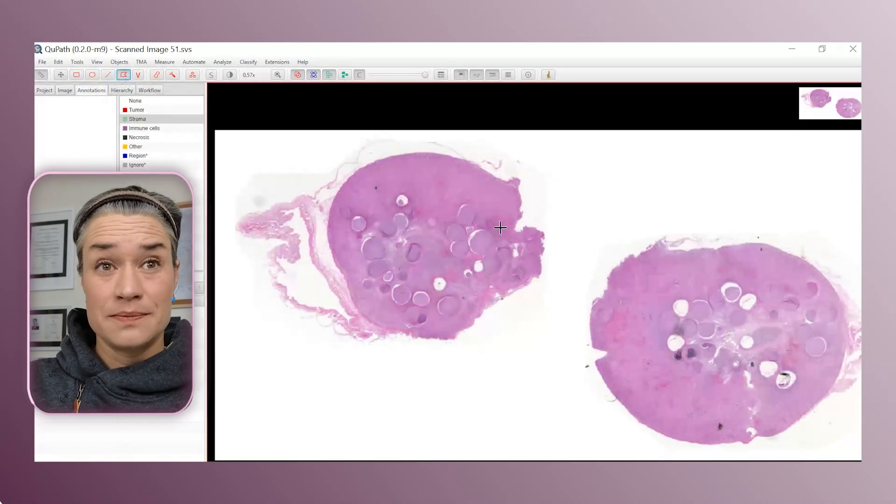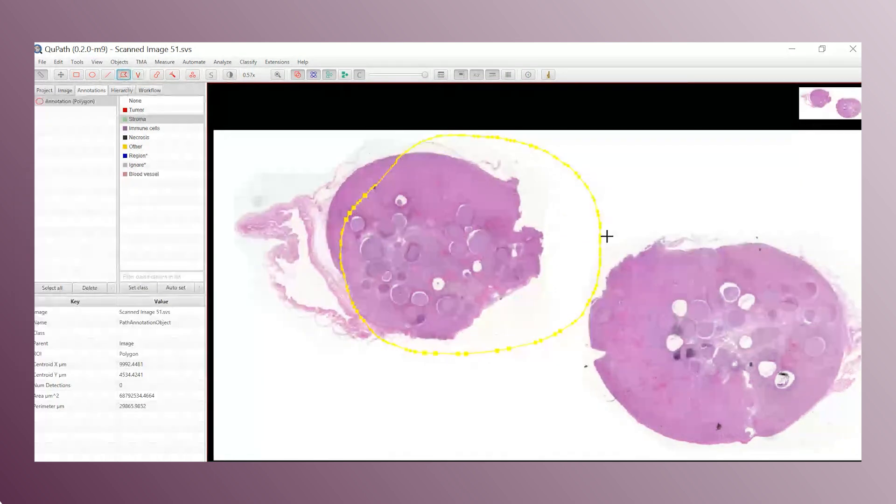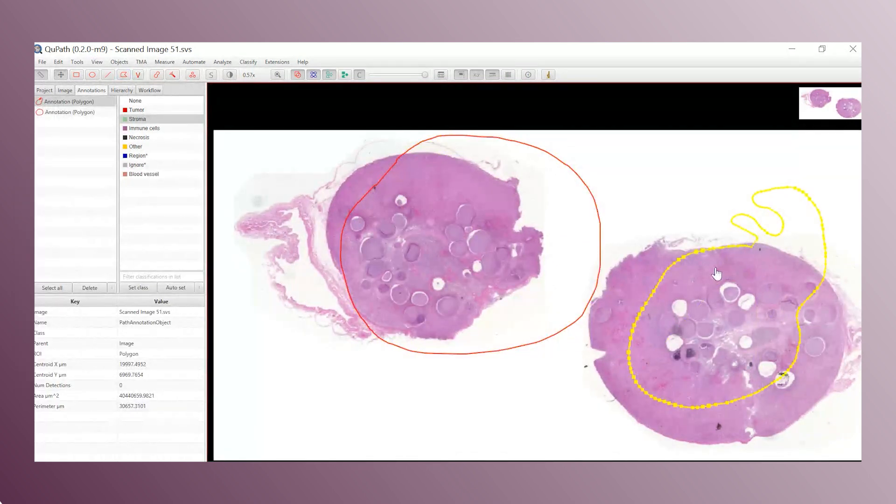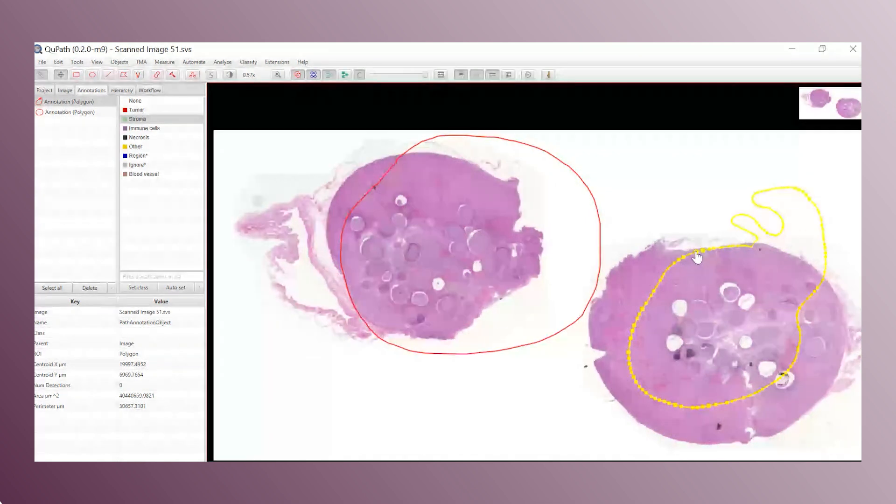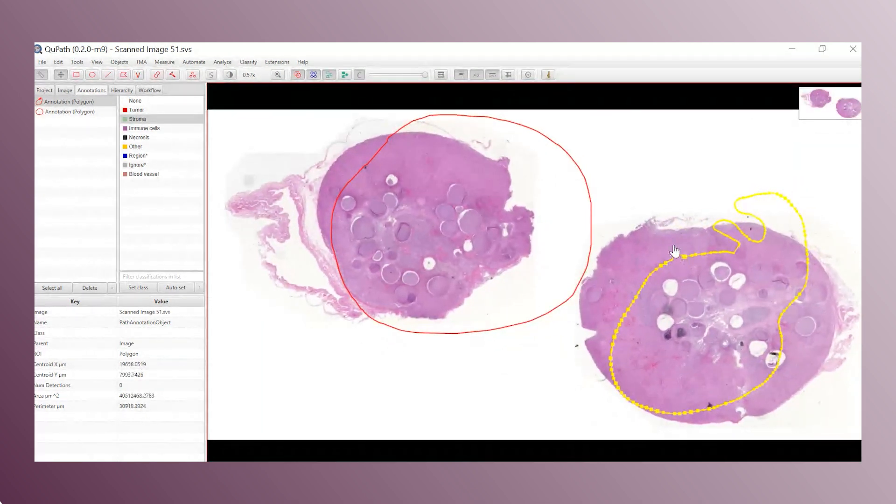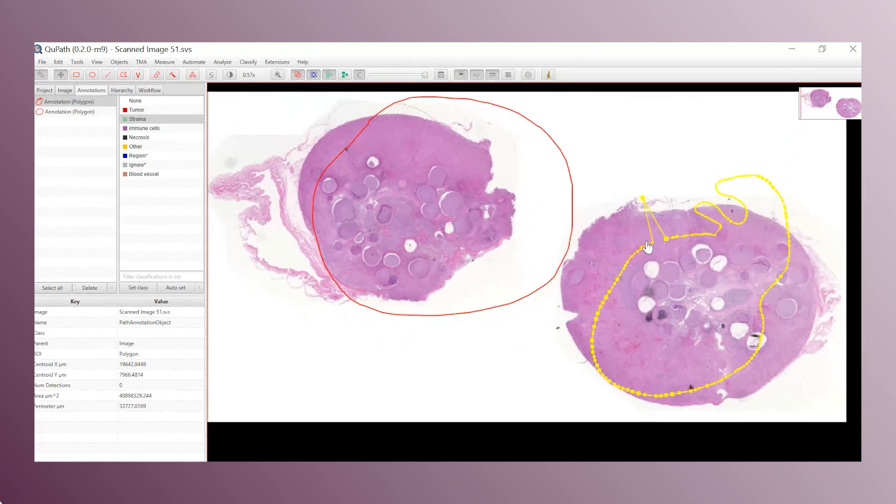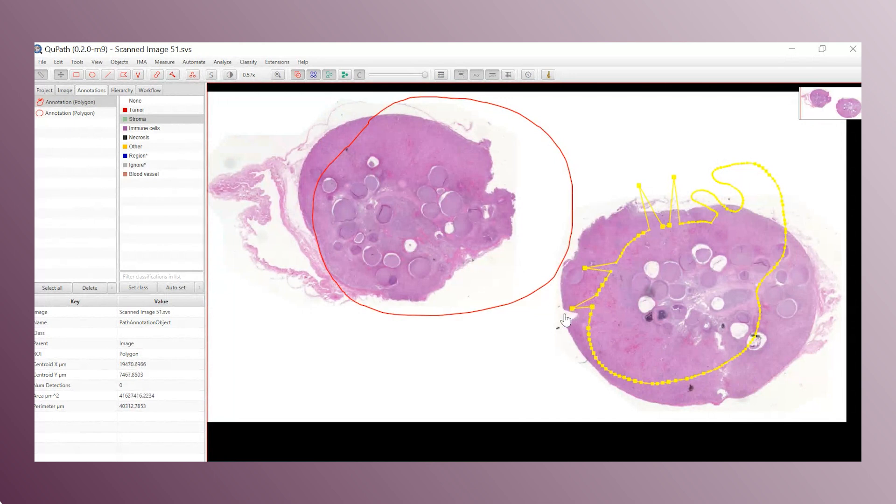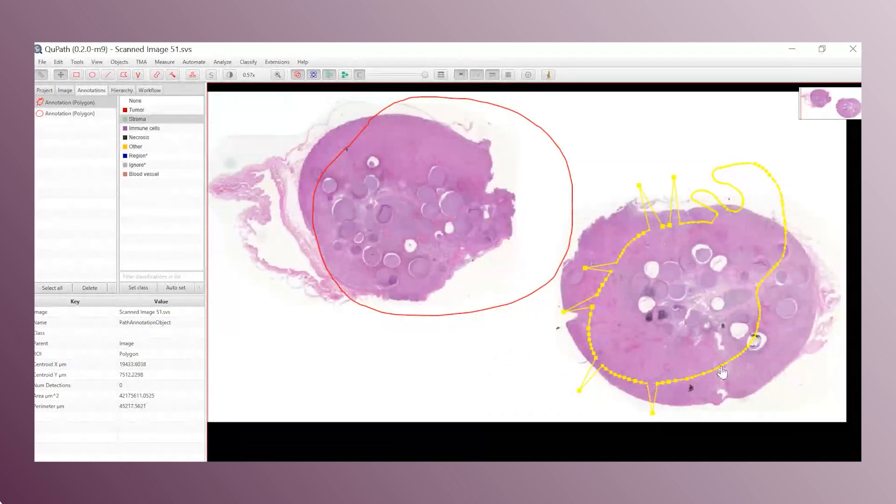Let's move to the polygon. In polygon, you can draw. This is me on my tablet. You can make very sophisticated shapes. The thing with the polygon is that it actually consists of a lot of these little points. And you can move every single one of them if you want to adjust it. But obviously, it's not that practical because then we're going to have some kind of star or a hedgehog. There is a better tool to do it.